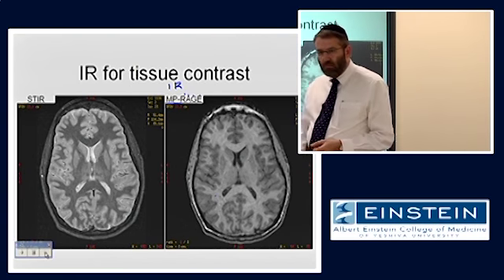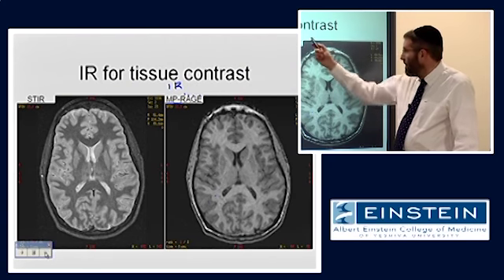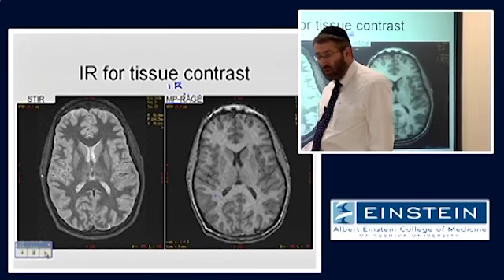So why would you choose this way to bring out a T1 contrast, if you're not interested in the suppression? Well, this image without that component would also be a T1 weighted image. But the gray-white matter contrast would not be nearly as good. Can you show why that is? Can I show why that is? So we could, you mean, could we diagram why that is? Sure.